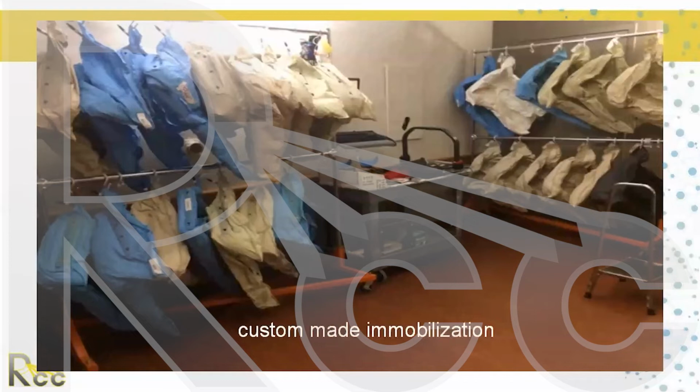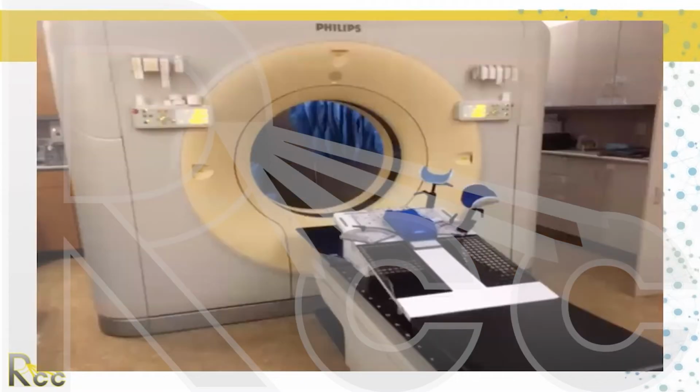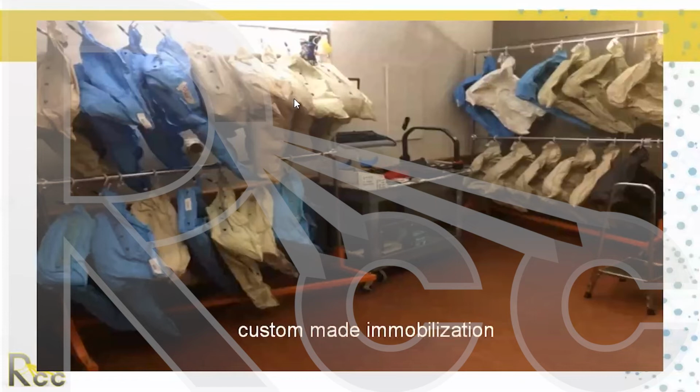We have a lot of immobilization devices called vac locks. The vac lock helps to immobilize the patient's body in the position that we want to treat it in. So we make the vac lock. In here, you can actually see some of the bags hanging back here where we make the vac lock. We image the patient, and then we treat the patient using this immobilization.